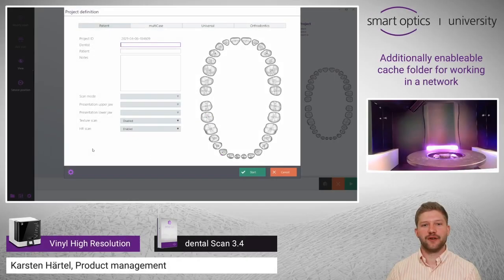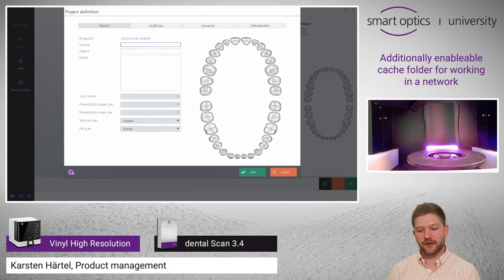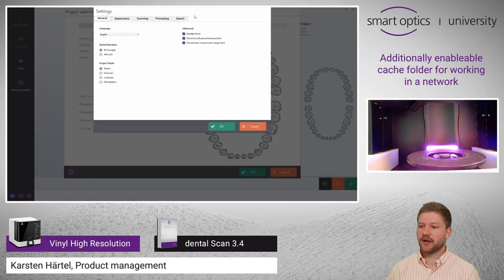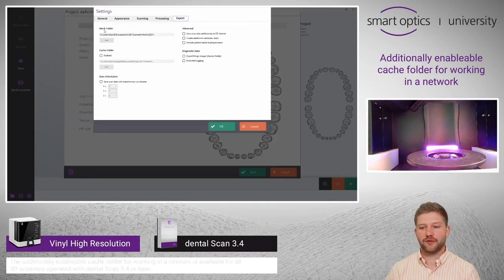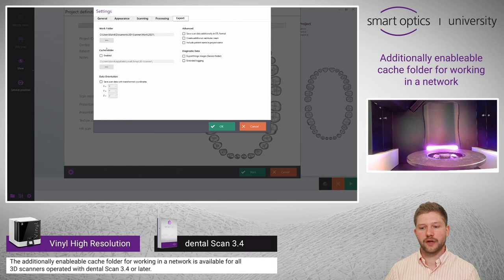This video is about the additionally activatable cache directory. Therefore I enter the settings, I choose export and now you see you have a work folder and a cache folder.